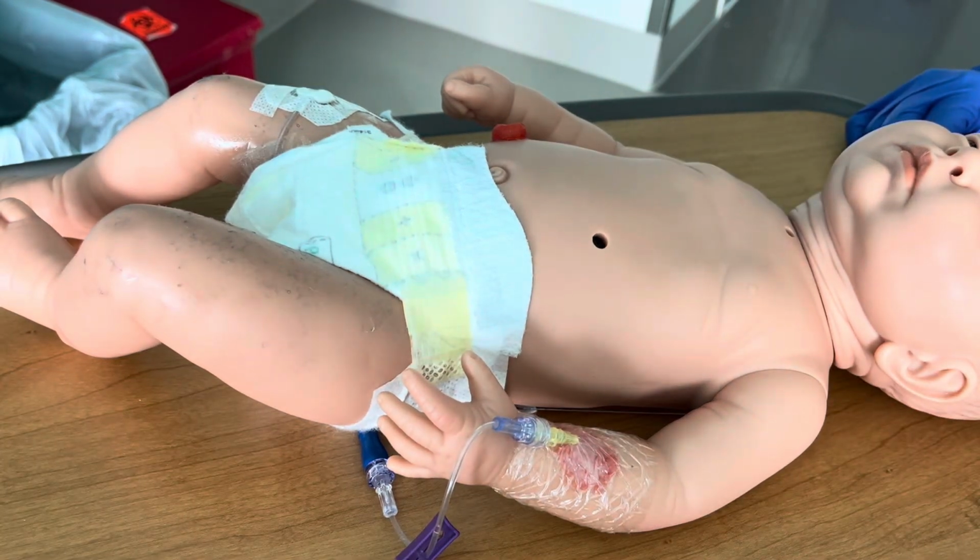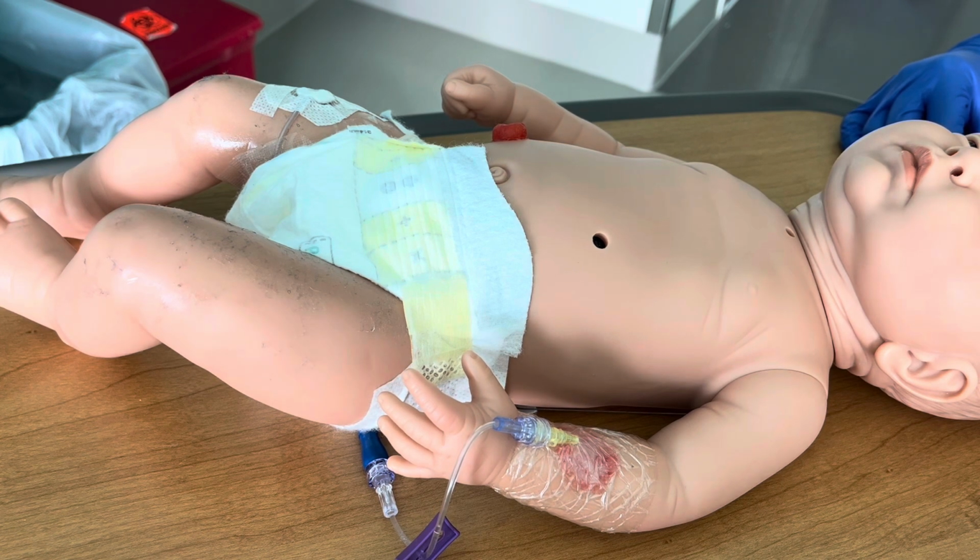Regardless of where the infiltrate is, you always take the measurement in the arm from the axilla to the fingertip. So even if the IV was placed in the foot, the calculations are based on body surface area, and the formula for calculating is from the arm to the fingertip, or of course, like I said, from the groin area to the longest length of the toe if you don't have arms available.